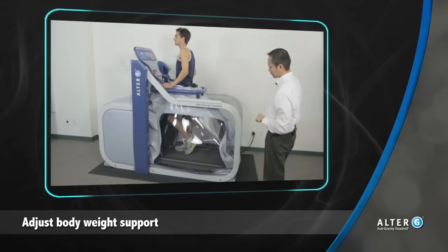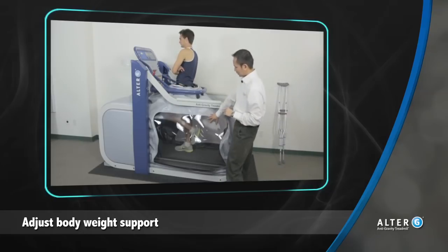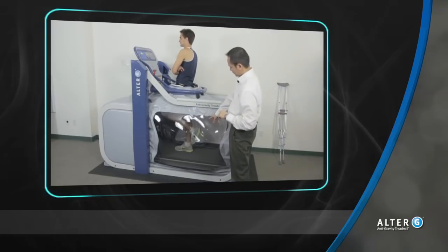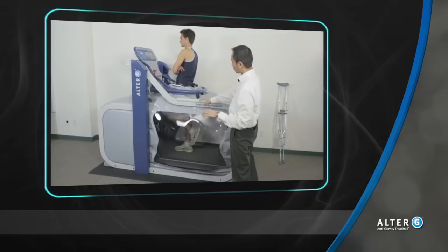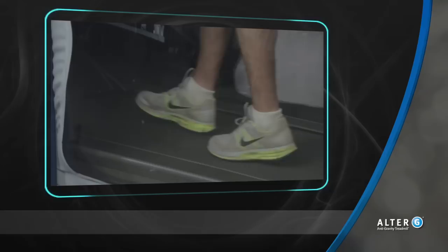Once calibration is complete, adjust body weight support to the level instructed by the physician or the protocol. Once the Alter-G is providing the appropriate amount of body weight support, the patient can now set the involved side down, knowing they are exactly where they are supposed to be.